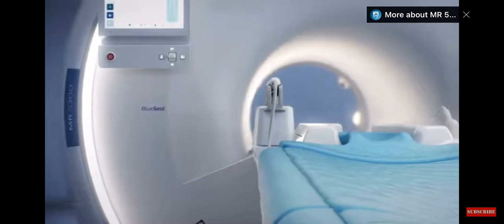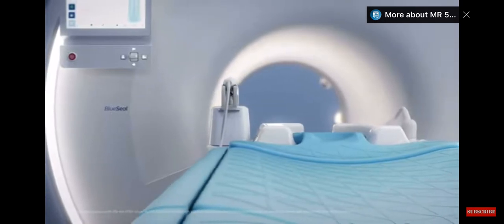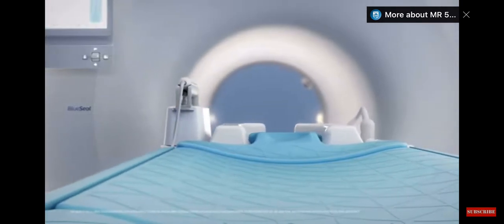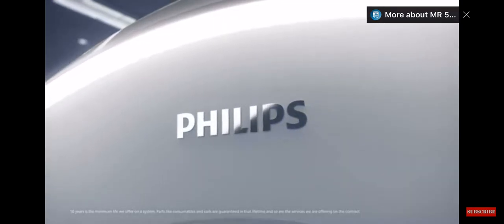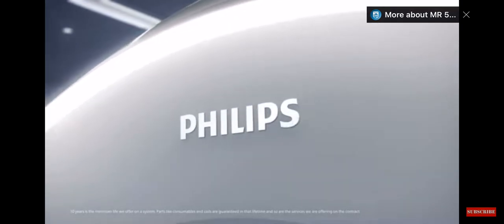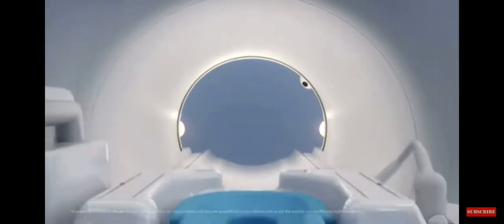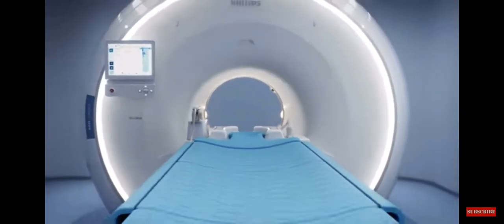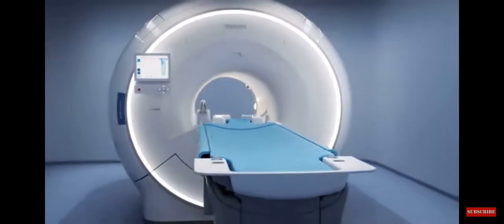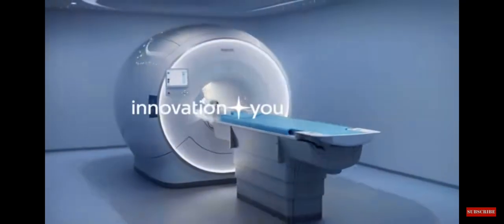And to lower the total cost of ownership, our service solutions assure performance for life. Make the smart choice with Philips MR5300.